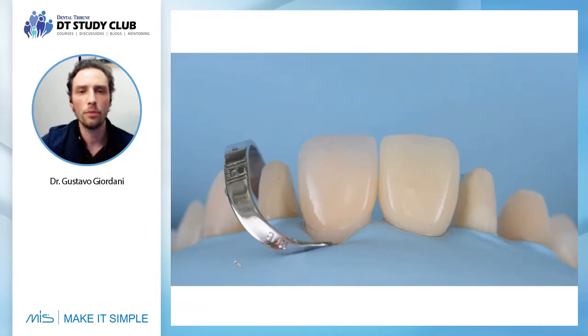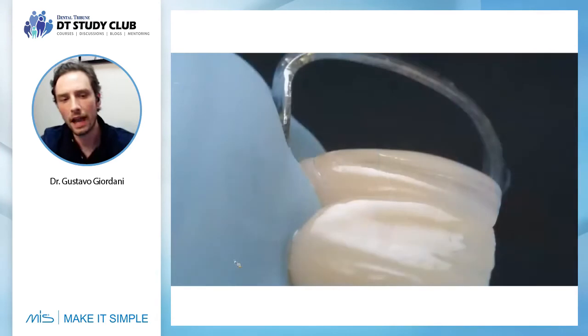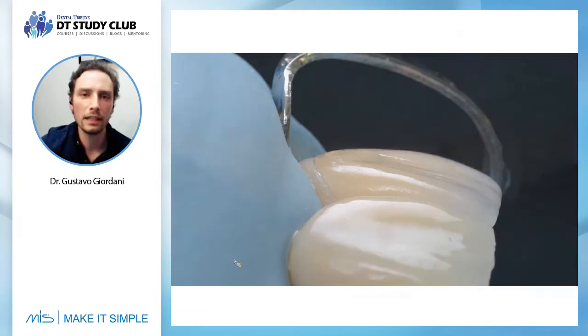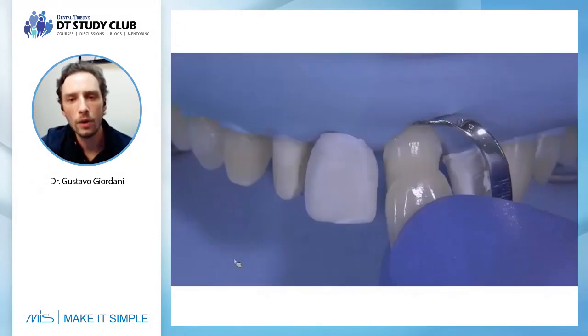The bonding process will be under the rubber dam, so you can have a better situation for cleaning, you can have a safe situation for cementation, and you see the fit of the monolithic restorations after cementation. And let's see a video of how we did the cementation.